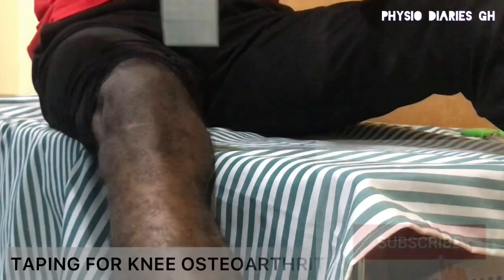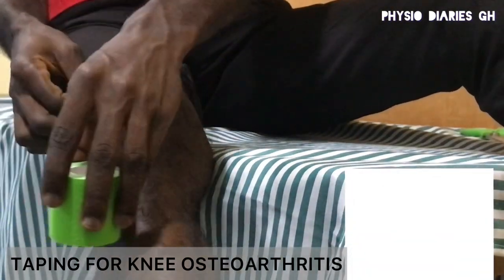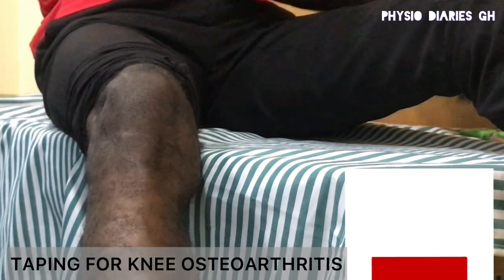Taping for knee osteoarthritis. Begin the procedure by measuring the length of the tape to be used from the top part of your thigh to the tibia just below the knee joint. Cut your tape according to that measurement.